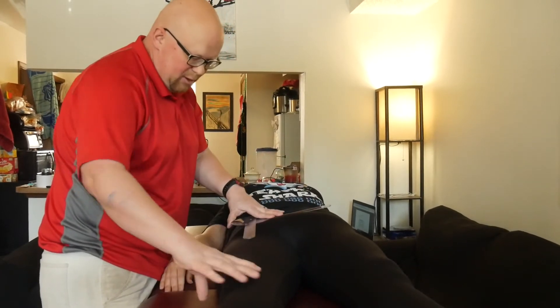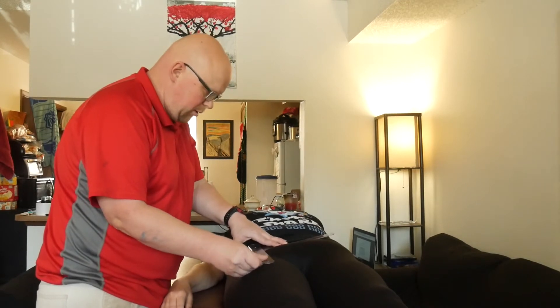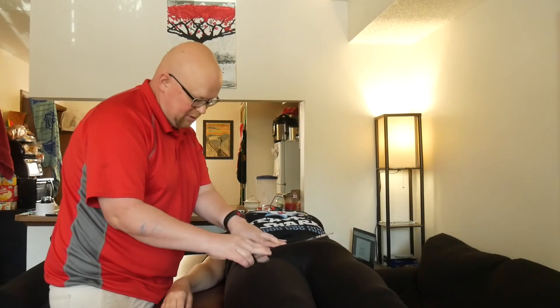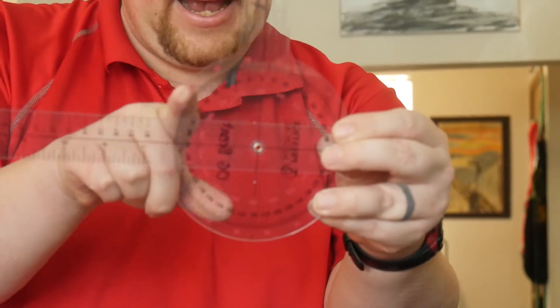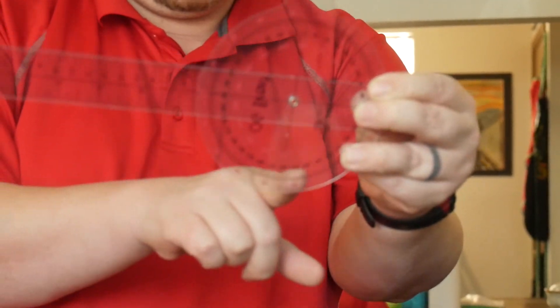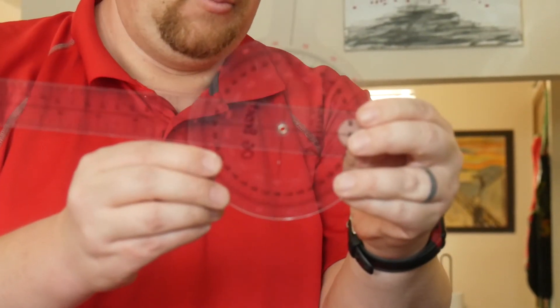Your distal arm is going to point right to the middle of the patella — mid-patella right there. You're going to use the red outside numbers, because we're starting at 90 degrees already. If you start with the red outside numbers to read, it'll give you the proper reading that you want for the movement.